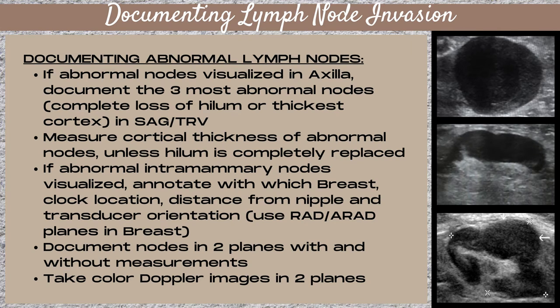You want to document them in both sagittal and transverse planes. Measure the cortical thickness of abnormal nodes unless the hilum is completely replaced and you can no longer visualize it. The cortical thickness measurement is a vertical measurement, an AP dimension. Document the axillary node in two planes — sagittal and transverse — with and without measurements.